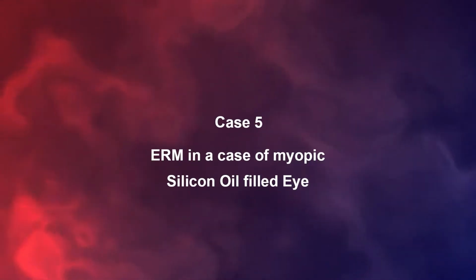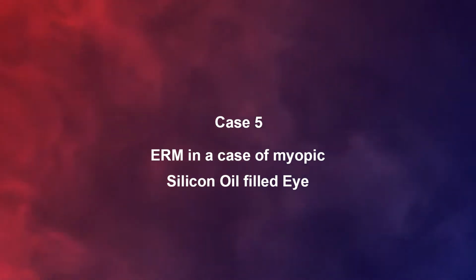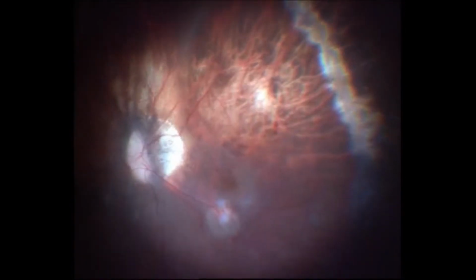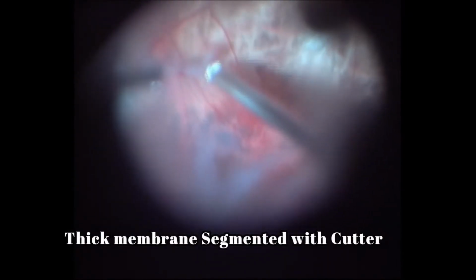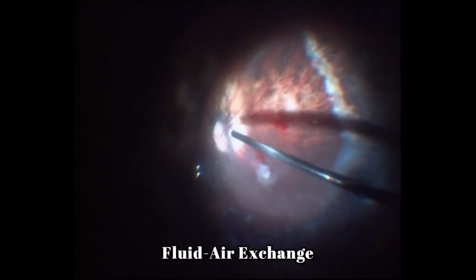This case had a membrane in a myopic silicone oil filled eye. 25 gauge cannula insertion was followed by silicone oil removal. The epiretinal membrane was peeled and thick membranes were segmented with the cutter, followed by case closure after fluid air exchange.